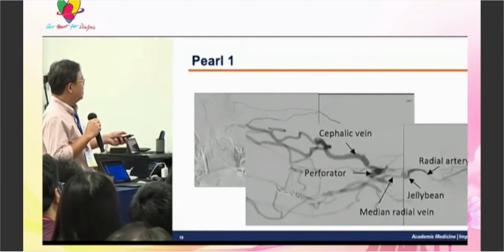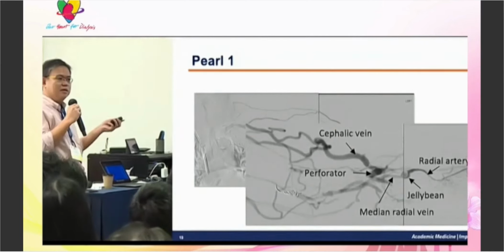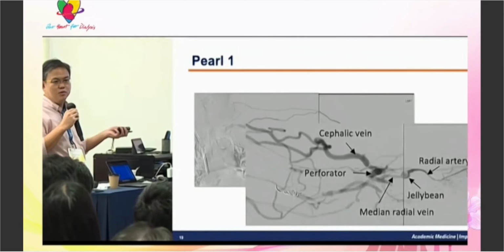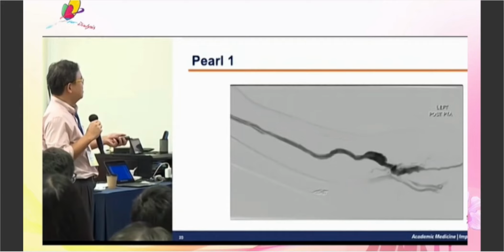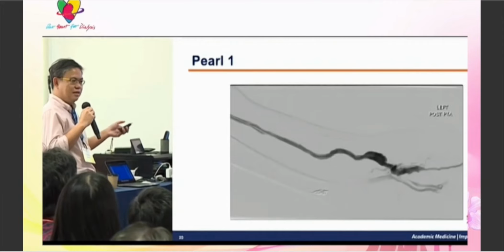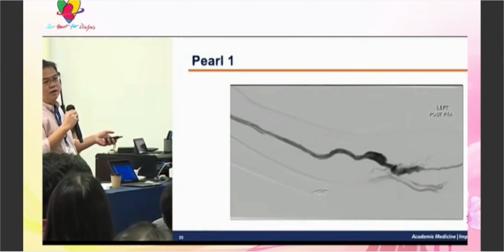And this is a zoom in on the disaster. Now, because in the pre-vein mapping, we already knew there was no way the blood was going to flow. What you need to do is bring back the patient. And then what I did was plasty an entire new channel for the patient to be able to use the upper arm cephalic vein for cannulation.